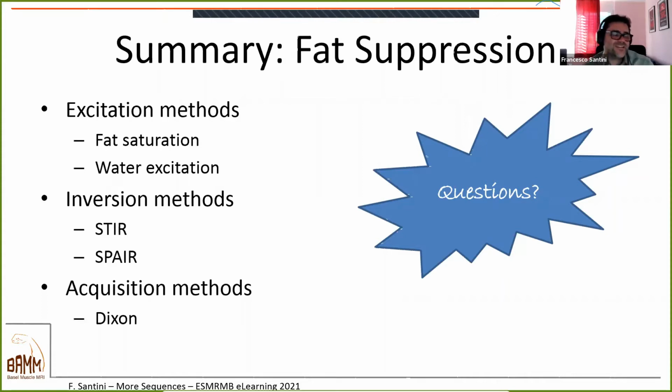of clinical sequence you would use. As far as I know, we usually use STIR, I think, in the spinal. I'm thinking spinal when you say bone marrow edema. Of course, also other joints can have that, but we don't use Dixons much for that application, as far as I know. But sorry, you don't need to interrupt, so you can go on. No, it's exactly what I was hoping for.